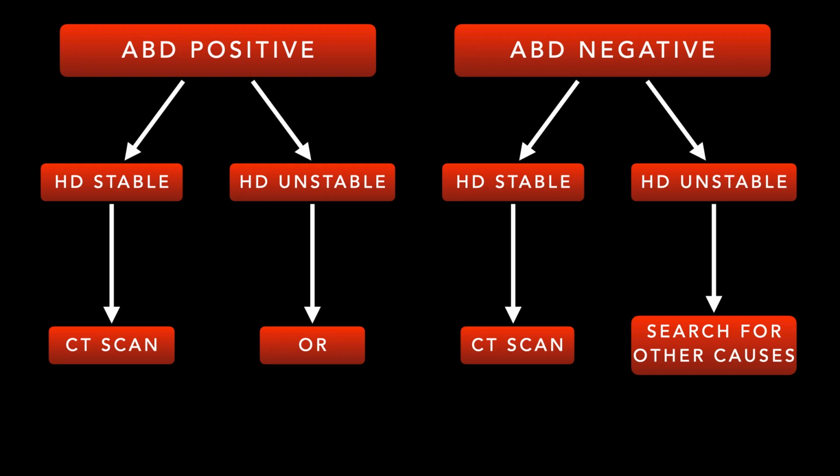But what is helpful in this context is you say, okay, I've got a patient who's hemodynamically unstable. The abdominal FAST is negative, right? We can make maybe a little bit of an assumption saying, if they're hemodynamically unstable, and the problem was coming from the belly, I should see a significant amount of blood in the belly, right? Because we presume that hemodynamic instability is from massive volume loss, right?